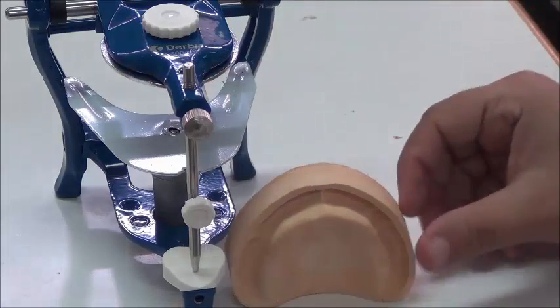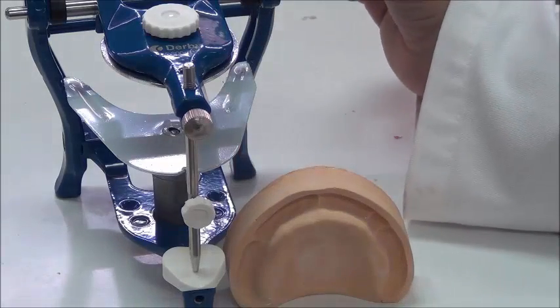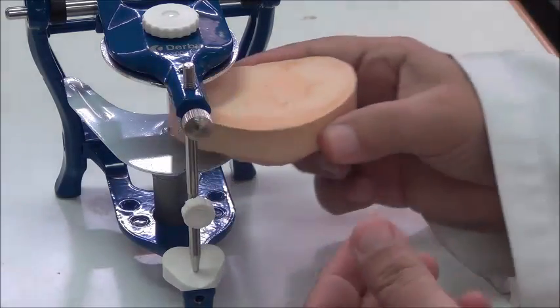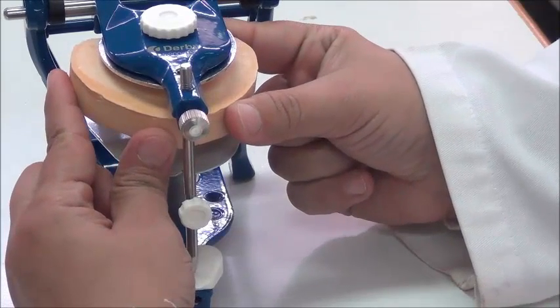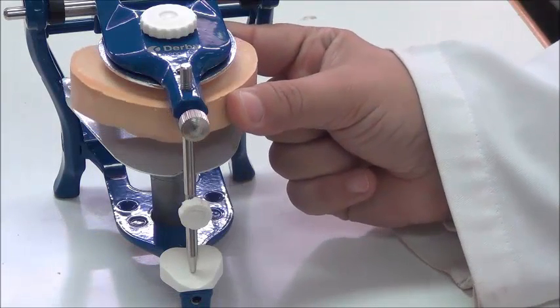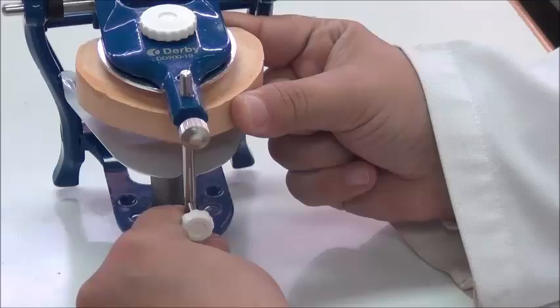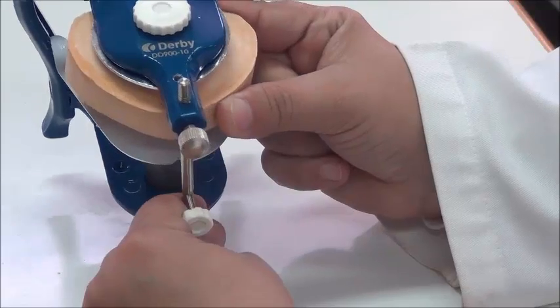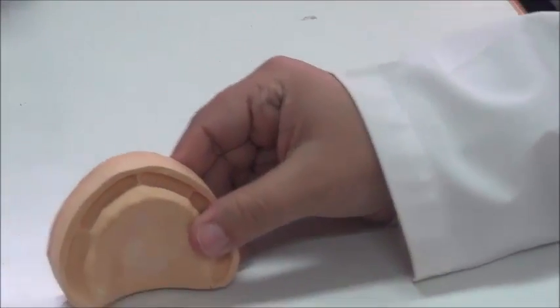Now, to mount this cast on our articulator for training purposes, we're going to use another method which we call arbitrary mounting. Arbitrary mounting means taking the cast as it is and trying to center it inside the articulator, in a way that it is centered in the middle according to the measurements that we have from our wax rims and so on. So once we want to put this cast and orient it in the middle of this structure, which is the articulator, we have to make sure that we have some reference lines that we're comparing it with. So we're going to go to our cast and use the cast itself to orient our work.